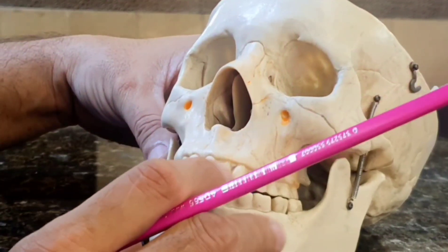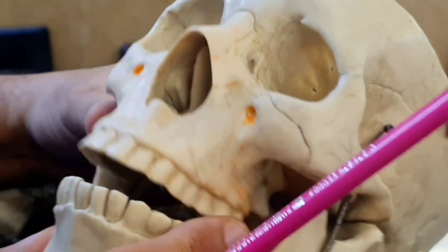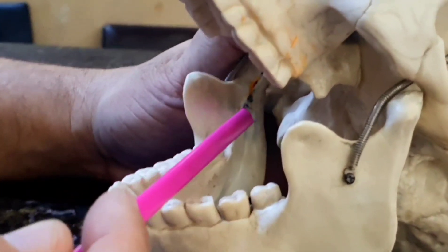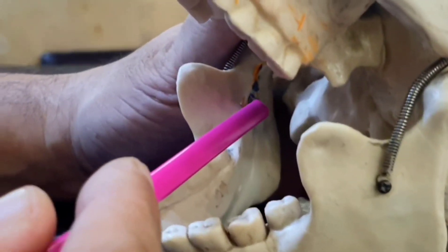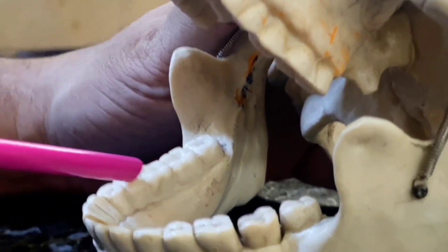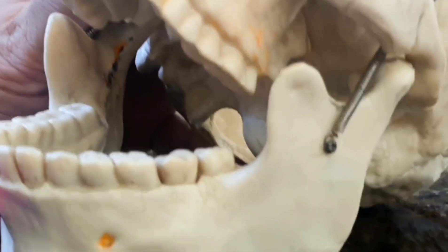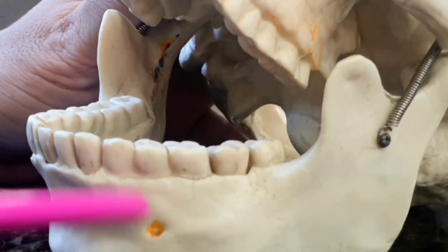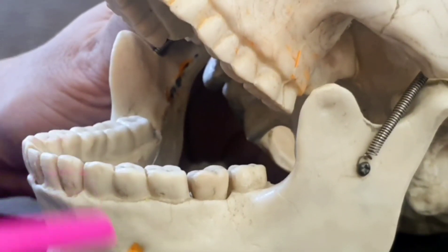One injection that is sometimes hard for people because they cannot visualize is the inferior alveolar nerve block. When you come to the inferior alveolar, have the patient open a little bit so you can put your needle and finger inside. What you're trying to aim for is the lingula — this notch. The notch is about a centimeter away from the coronoid notch, and that's where the nerve enters the mandible. The nerve travels inside the mandible, part of it comes out at the mental foramen, and the rest stays inside the bone supplying the anterior teeth individually. When you give the mental block, you get that portion of the nerve as it exits and also the portion supplying the incisors.